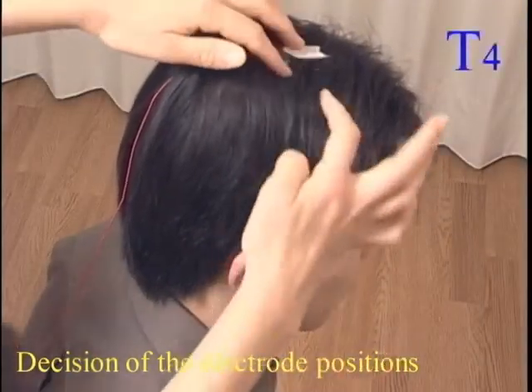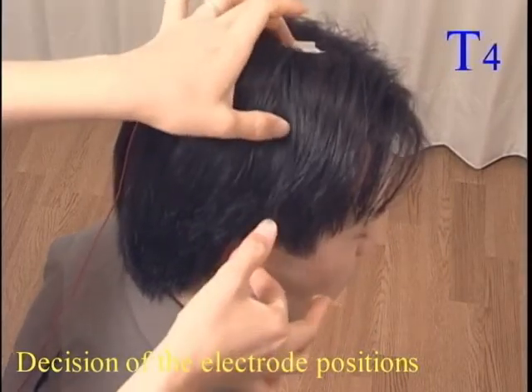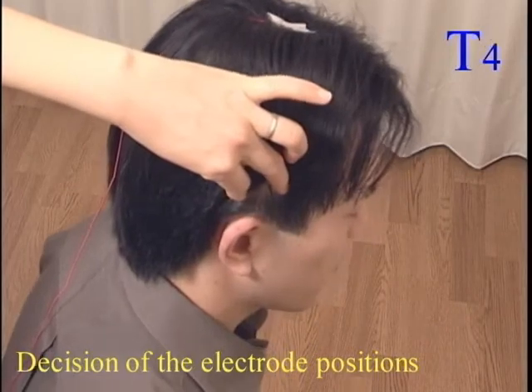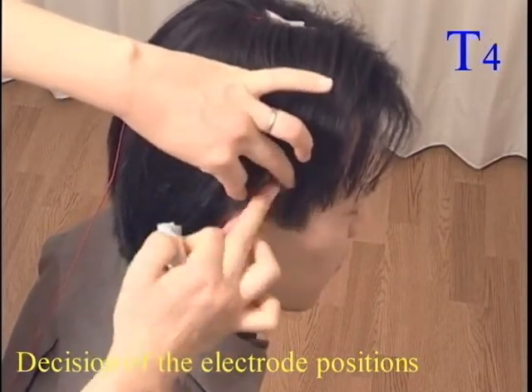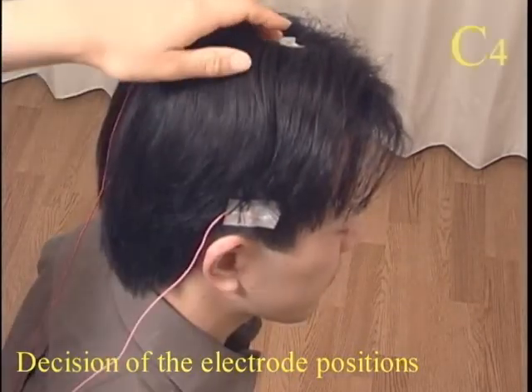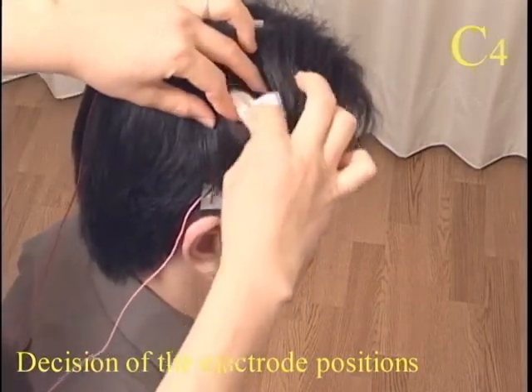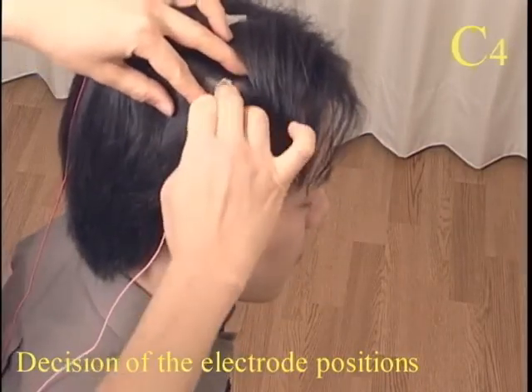After deciding CZ, form a line joining CZ with the tragus. The 1/5 point from the tragus is the T4 position. After deciding T4, the midpoint between T4 and CZ is C4. Repeat these procedures on the left side for T3 and C3.